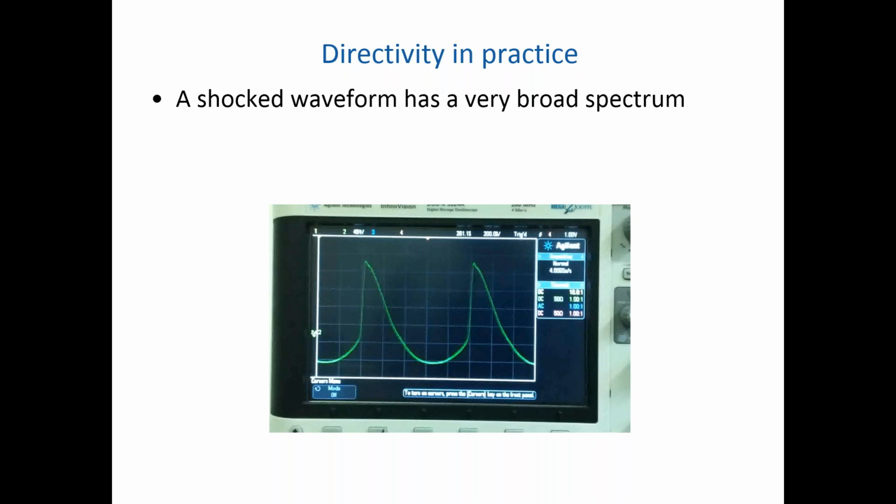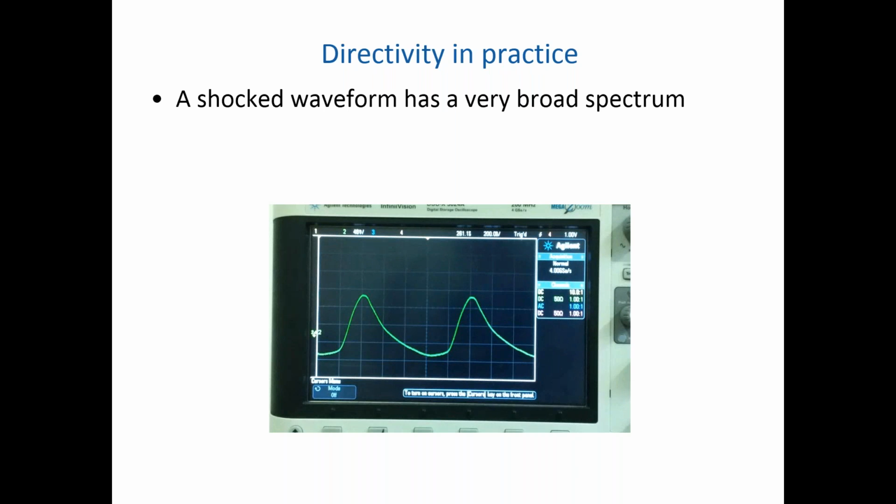Now, the interesting thing is that in order to get very sharp signals, as we were seeing at the very top of the waveform here, we need lots more high-frequency harmonic content. In order to get this long, slow, sweeping peak negative going excursion, that tends to be dominated by our peak negative content, but also our low frequency content. So I will run that animation one more time, because we see that the peak negative doesn't vary massively as we rotate around, whereas the peak positive changes significantly. This is a fine example of how the hydrophone directivity function is affecting some frequencies more than others.